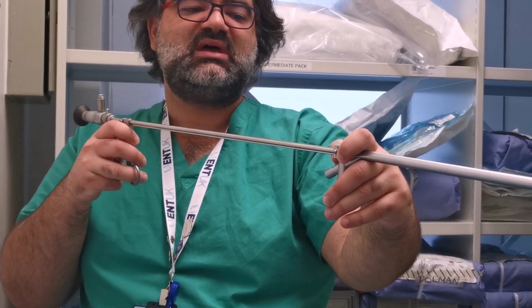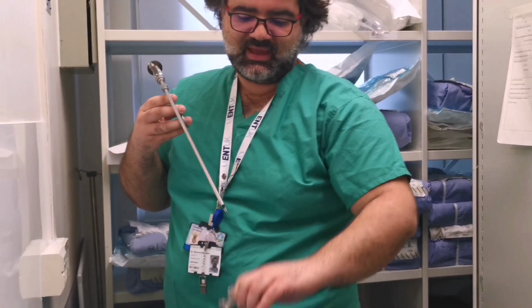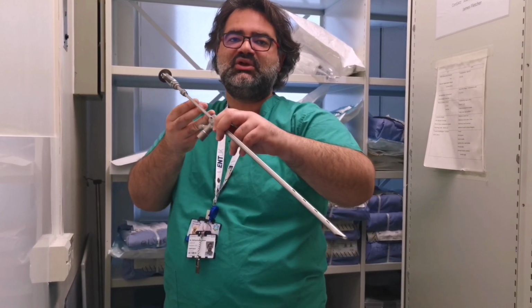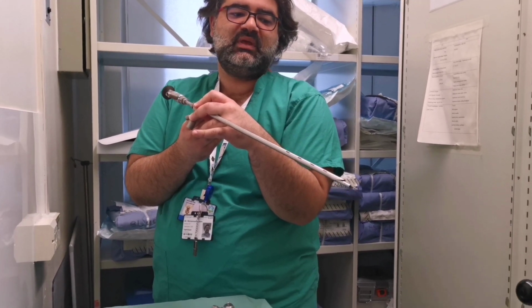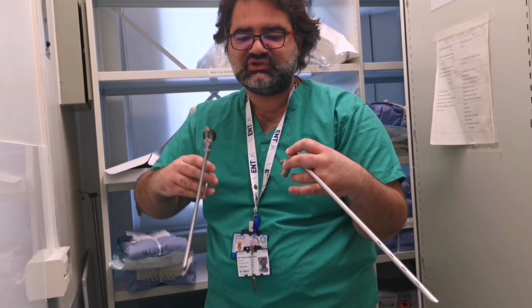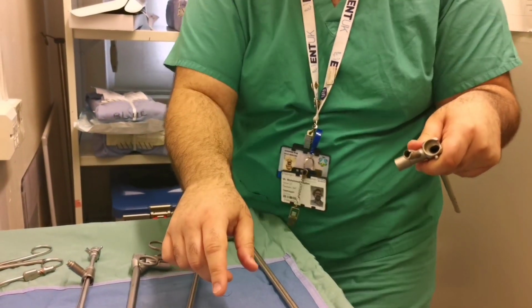You will find that with a size 8.5, it's easy to fit your forceps in any direction, but you will find that with the smaller scopes that essentially you might get stuck. If you go into a vertical direction, you would not be able to fit it directly in, but if you go in a little bit of a lateral position, you will find that it still goes inside. So even with small bronchoscopes, you can still fit your forceps in, but you just have to introduce it in a lateral oblique position, so it slides in and out. Maybe putting some saline on the rod may help you introduce it a little bit more smoothly.